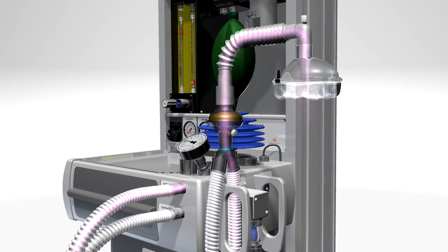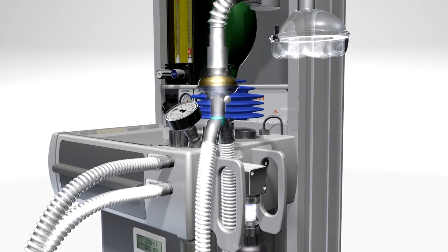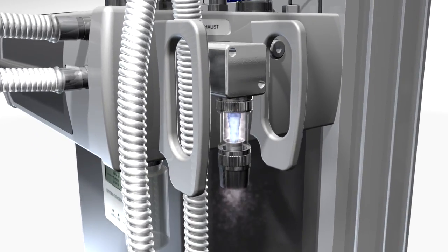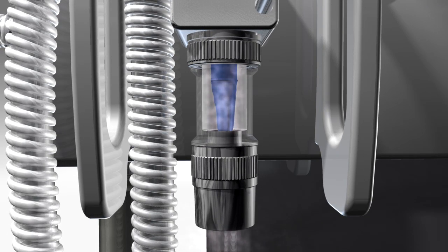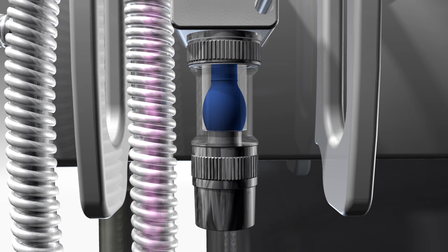The expiratory limb of the Y-piece channels gas to an inflating valve on the UAM that functions like an ambu valve. It uses a balloon made from long-lasting silicone which closes during inspiration to direct gas into the lungs.